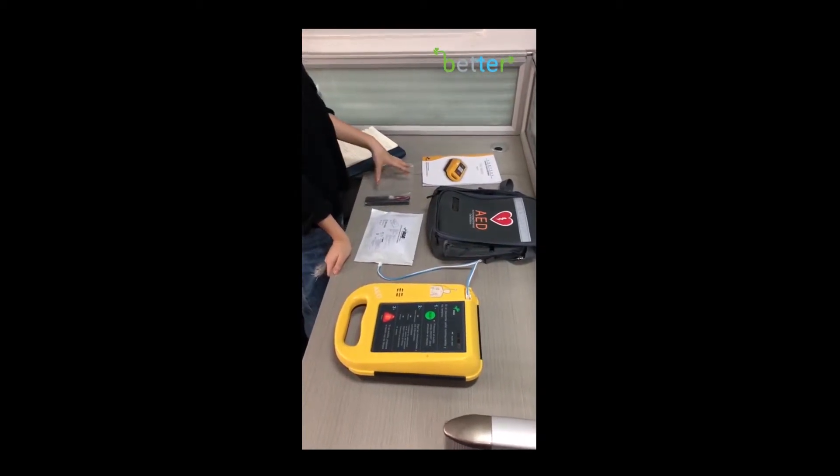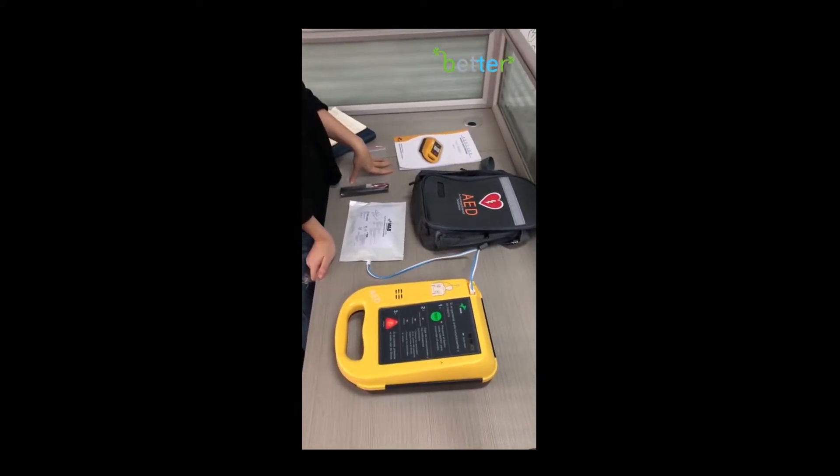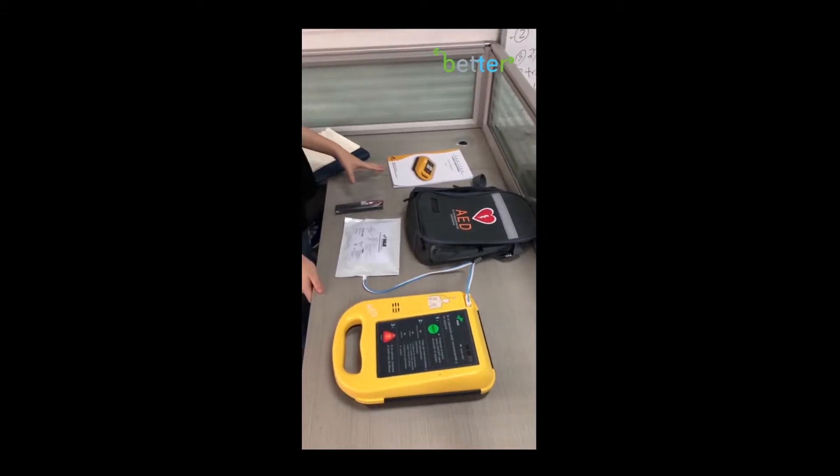Hi everyone, this is the video from Beta Instruments Company. Today I'm going to show you how to use an automatic external defibrillator.